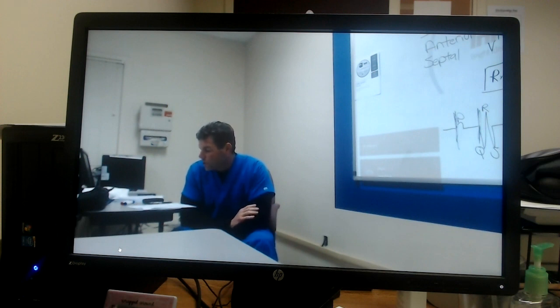106. During the first stage of a Bruce protocol stress test, the patient reports feeling lightheaded and states that he was going to pass out. Which of the following actions should the technician expect the provider to take? Yeah, stop the test and help the patient to a nearby chair. Always going to stop the test. You don't want to have the treadmill belt rolling and think you're going to be able to put them down on a rolling belt and do CPR.